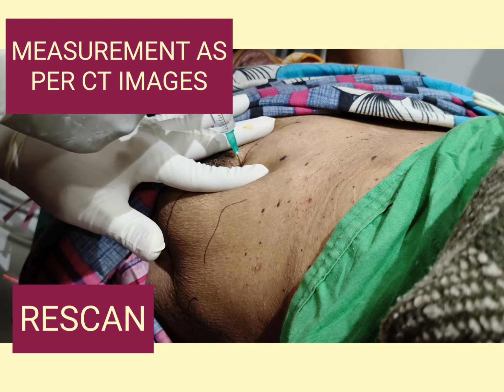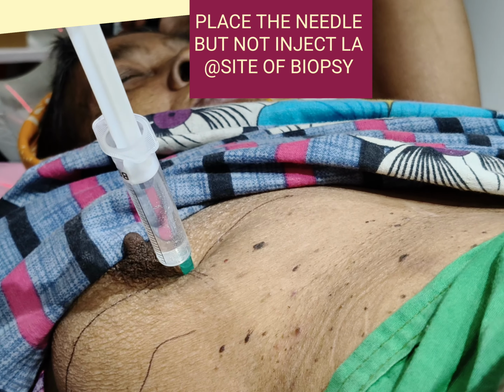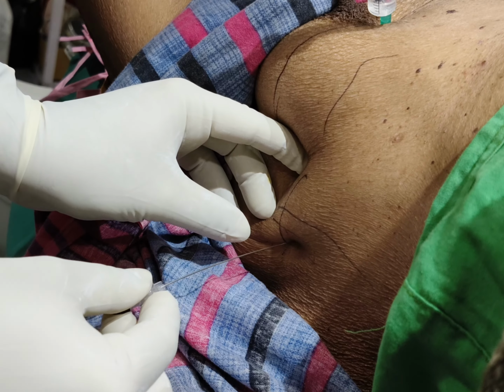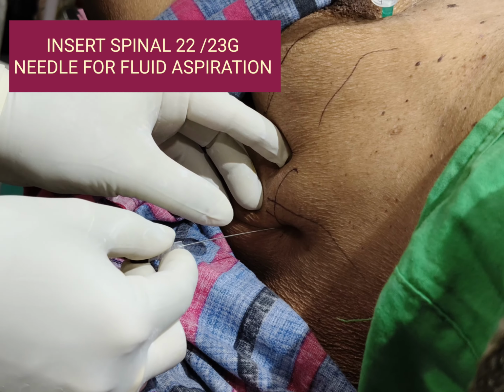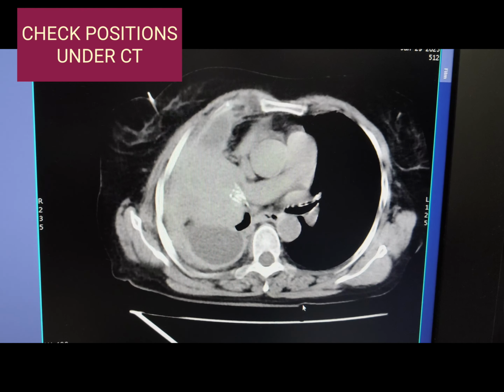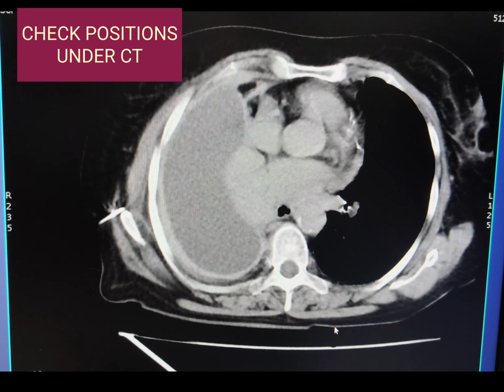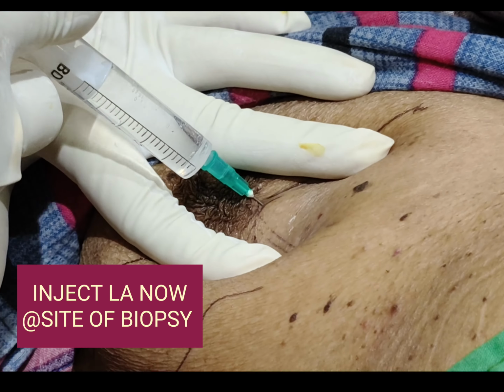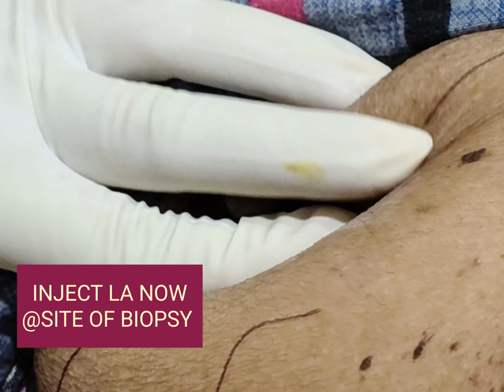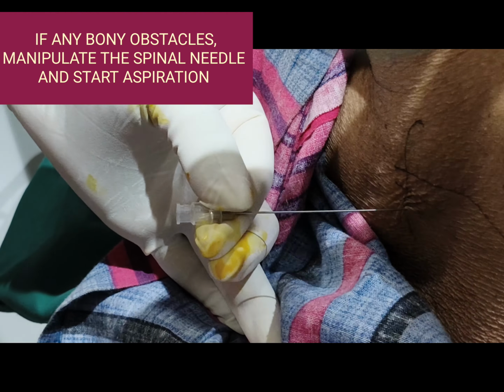Under CT scan guidance, we can measure the distance of the lesion and the accumulated fluid from the skin surface, and we are inserting the needles for confirmation of the needle position before injecting local anesthesia and aspiration of the fluid. And after confirmation, we are injecting the local anesthesia. Yes, the positions are confirmed.